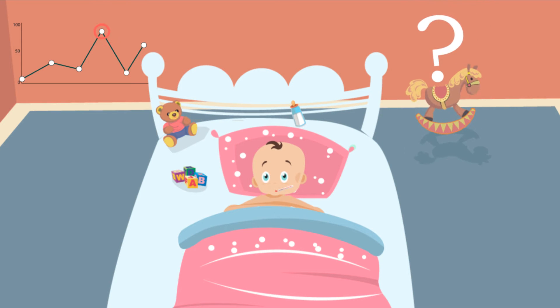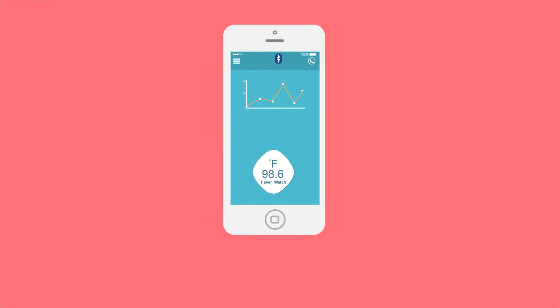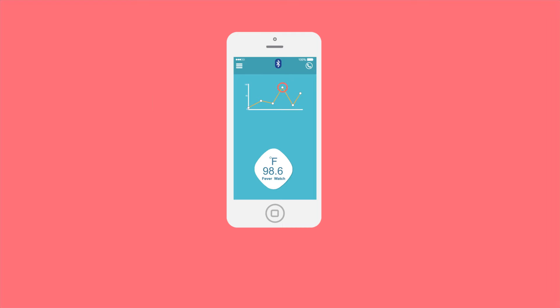How do you monitor your child's fever spikes and act swiftly anytime, anywhere? 98.6 Fever Watch is the world's most compact continuous fever monitoring system.